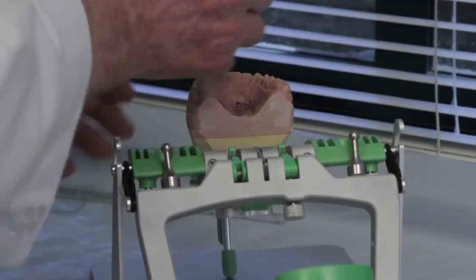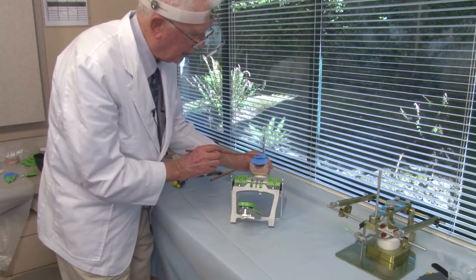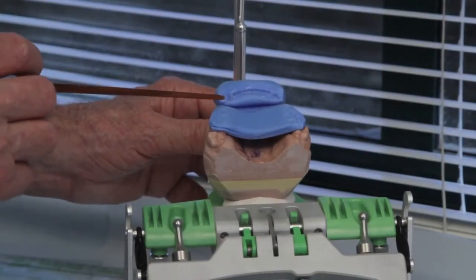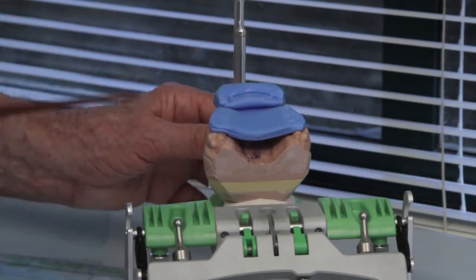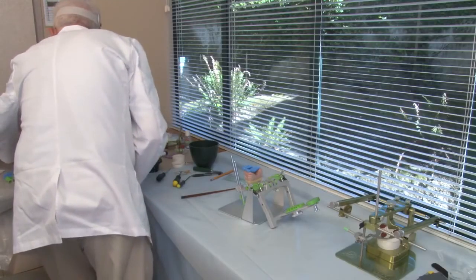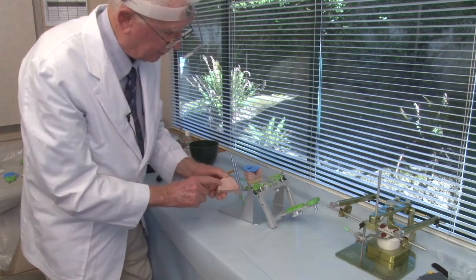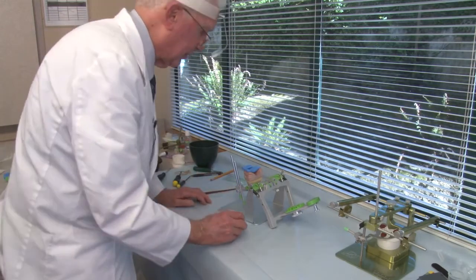And so I'll put my wax bites on the upper. There we go. You have to make sure that the posterior and anterior sections of the wax do not touch. If they touch, you have to take a scalpel and cut away the area that they touch. That may prevent the wax from seating onto the teeth correctly. Great. Get the lower model. Notice I have retention grooves cut in the lower model. Now I'm going to put the lower model on and take a look at it.